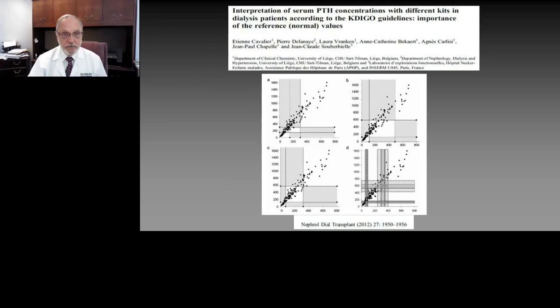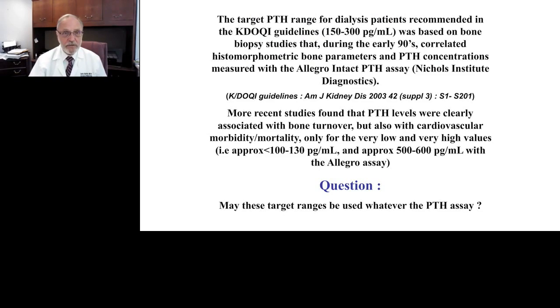Here you get much fewer with this assay, and here you get somewhere in between. So it's not ideal by any means for trying to achieve homogeneity or validation of these practice recommendations.